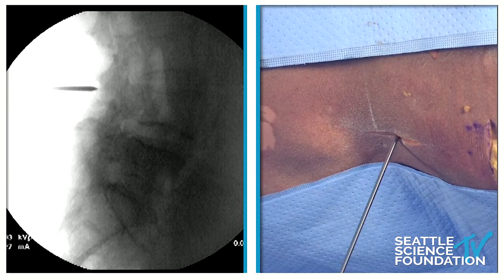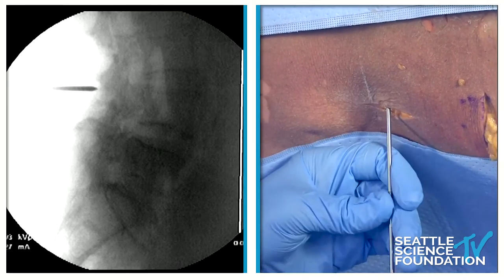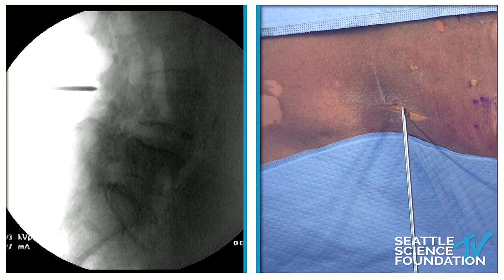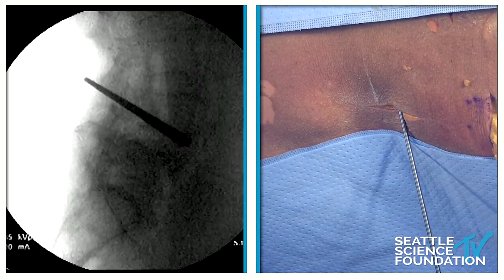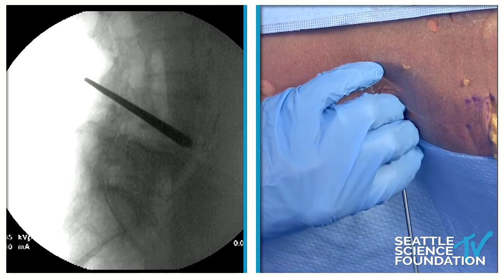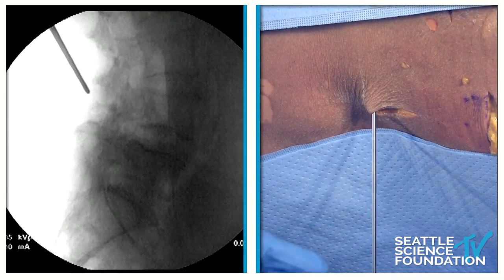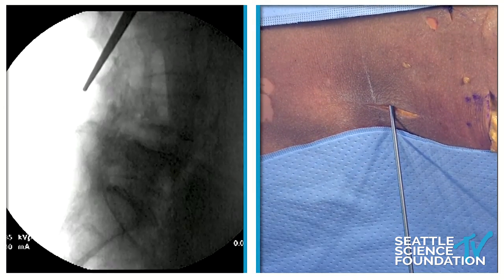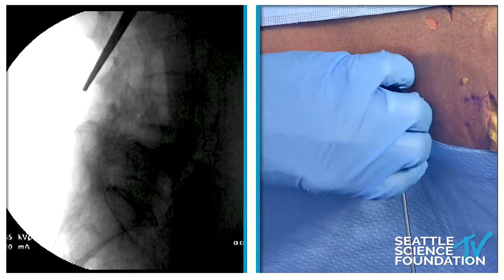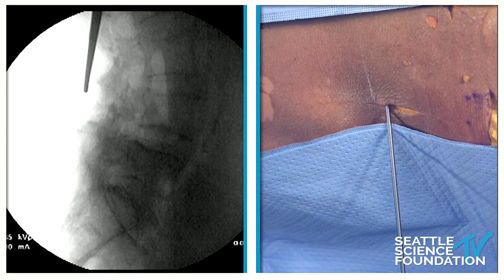I'm going to make an incision right here, and then we are going to go progressively down until we reach that point as anterior as we can get it, into the location between the spinous processes. We'll guide that just a little bit inferior, and we're starting to feel a little bit of bone right there. We're in the area right between the spinous processes, and at this point we're just directly posterior to the inferior articular process.